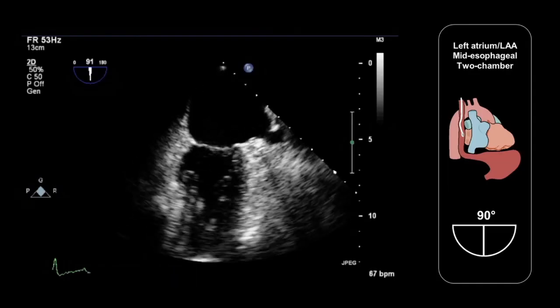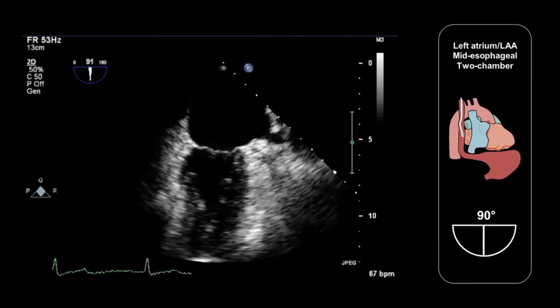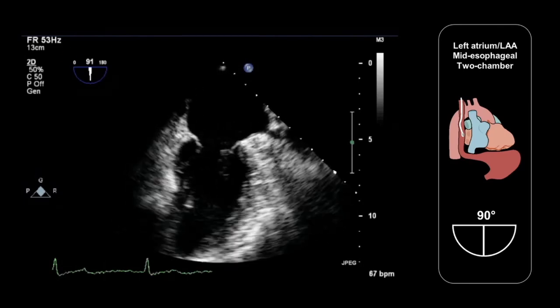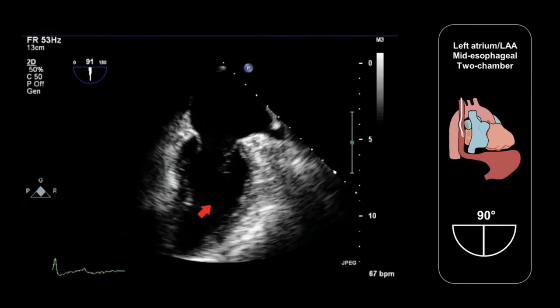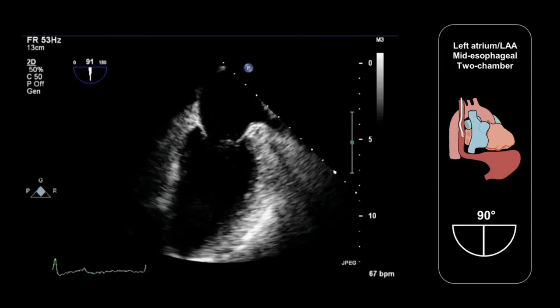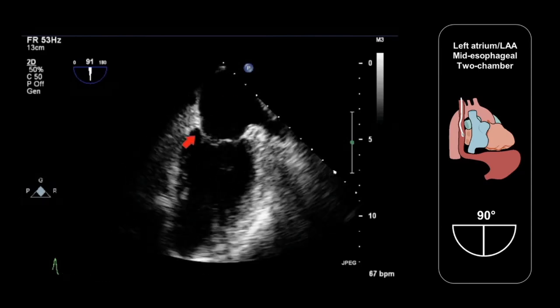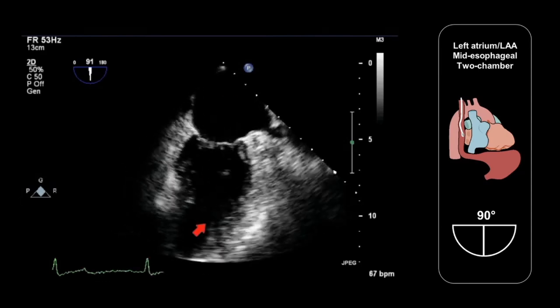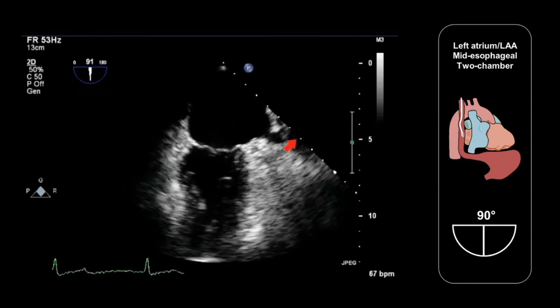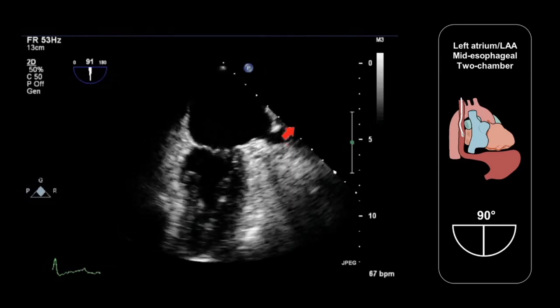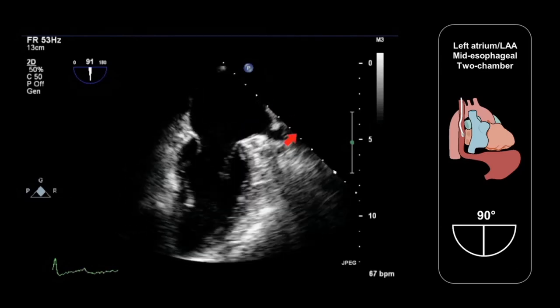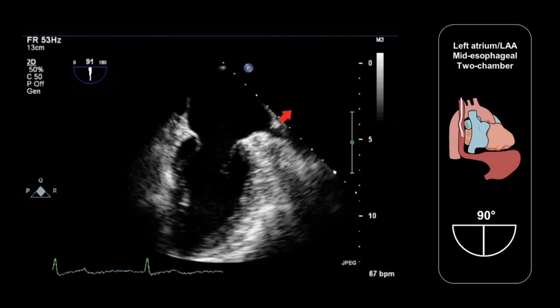An imaging plane angle of approximately 90 degrees will give us a two-chamber view of the left atrium, mitral valve and left ventricle, and we can just see the left atrial appendage coming into view at the edge of the sector.